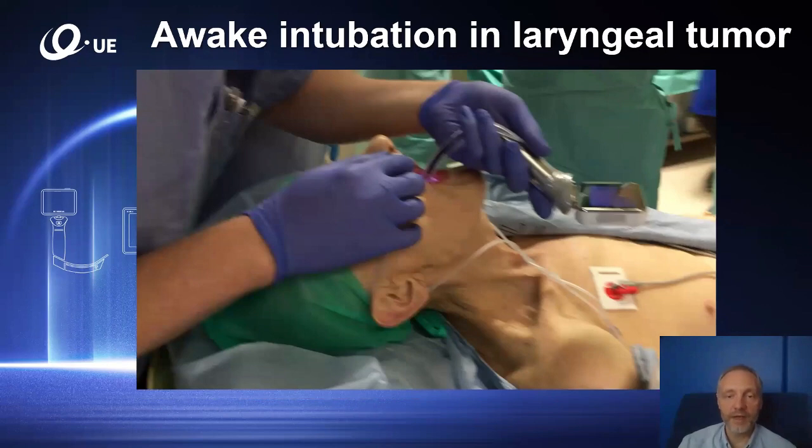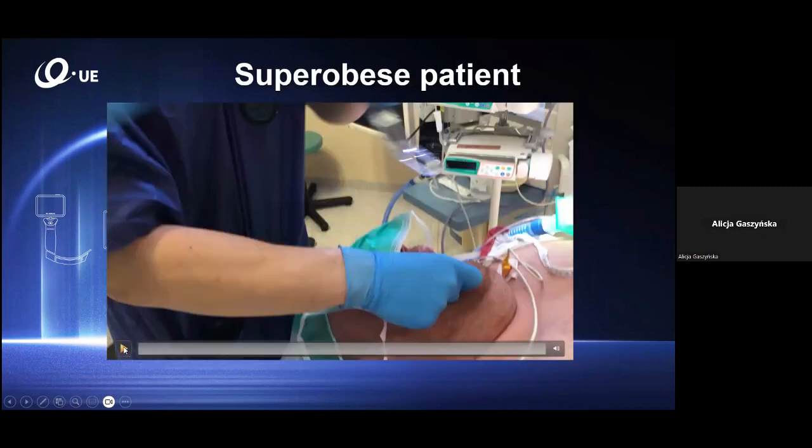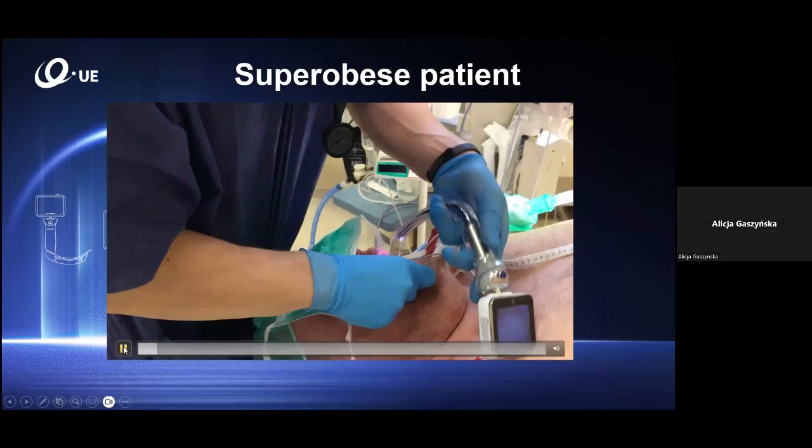Patients with difficult airway, predicted difficult. Okay, so I'm sorry for these problems with playing videos. So just again, I will try to show you the videos.